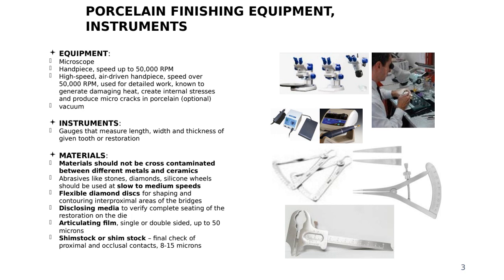Redefining. Like always, at the end, after you finish building up your crown, and you look at it and you're like, okay, it looks good, right? I'm ready to move to the glaze phase, but maybe I just want to redefine a little bit of anatomy. So this is the time when you can do it. What burrs are you using for that? For that, maybe you want to use a very thin and fine diamond burr, like a flame shape, just to go in there and open up the grooves a little bit, so make them look more natural.